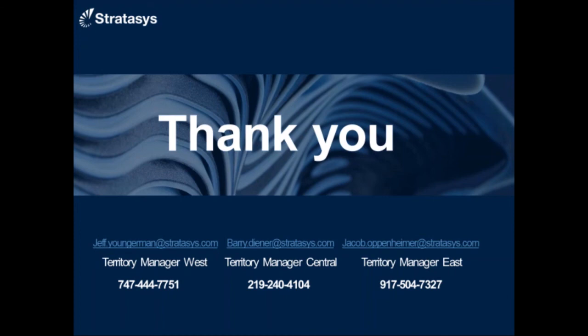Okay. Cody, what about printing crown and bridge restorations? We're currently testing that with Stratasys. What we've found so far is that it creates somewhat of a rough surface, so we're playing around with a couple of different support materials and different print processes or specifications to get a smoother finish. I actually did a test this morning and got a very smooth finish. As far as fit goes, like Jeff said, you can do any open STL restoration. Fit and marginal integrity would be based on the scan, the design process, and the parameters built into the design software. So from a standpoint of can it work, yes it can.